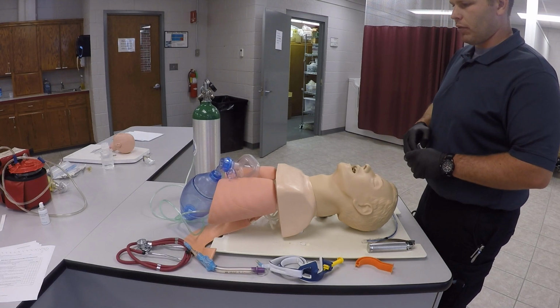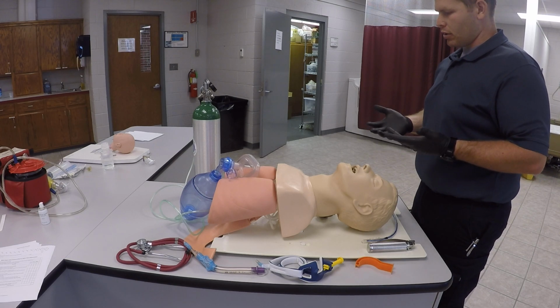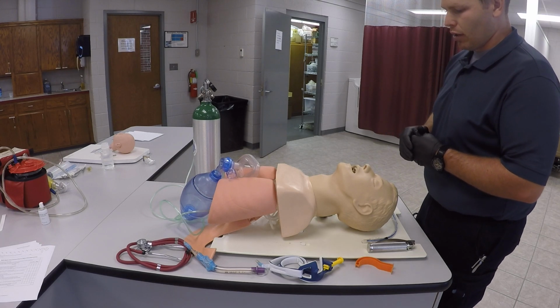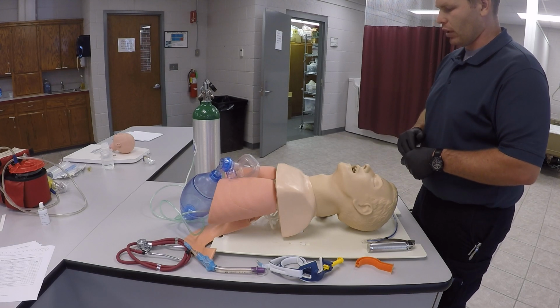Alright, we're going to go ahead and get ready for rapid sequence intubation. I'm going to make sure I have my standard precautions on, got my gloves here. First thing we're going to do is look externally to see if we have any masses, if the patient's obese, anything that would predict a difficult airway.